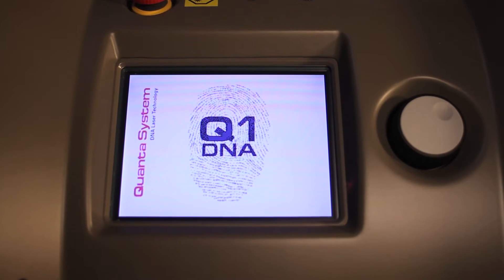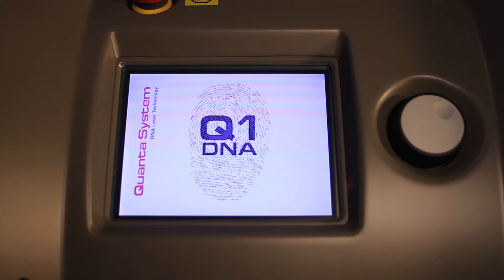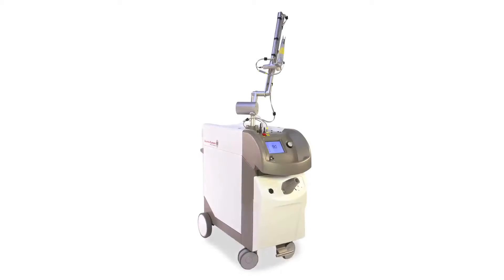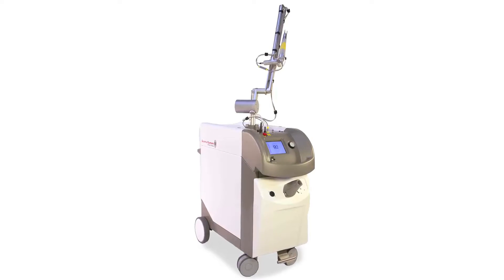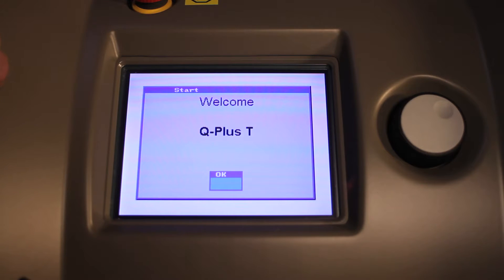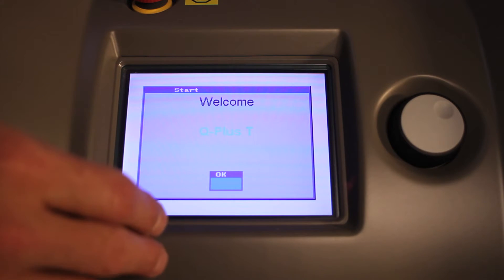This is the screen of the QUANTA Q Plus series. The Q Plus C is the most popular configuration and actually has three separate wavelengths. It's a touch screen — to move to the next screen, you simply touch the main screen. It's known as the Q Plus C, or Q Plus T, which is what it was originally cleared through the FDA.